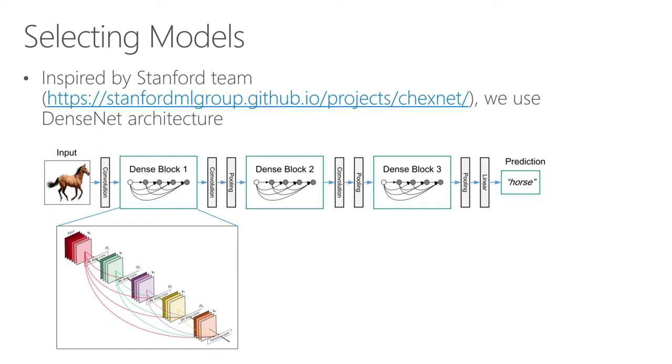So that's why we have this model called DenseNet. Basically, it's the state of the art model for image classification. And it's very smart, because usually when you have very deep neural networks, all the gradients will vanish very quickly. So it has some very smart way to solve that problem. I see. So this is my understanding, help me out if I'm wrong. When we're talking about deep learning, the deeper the network is, the better regularized it is.